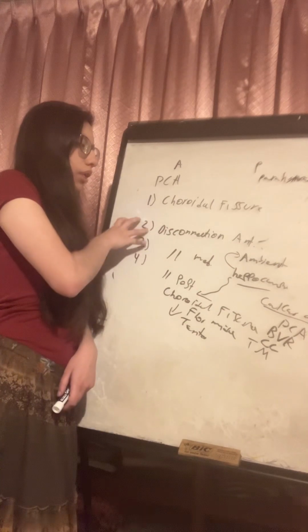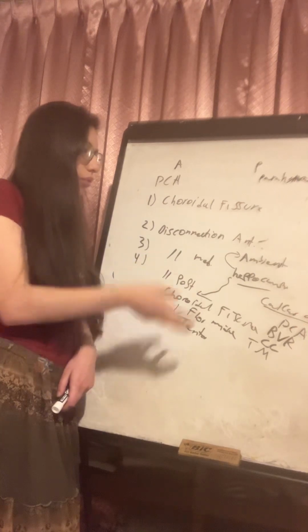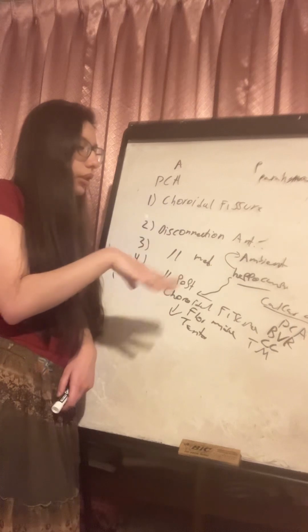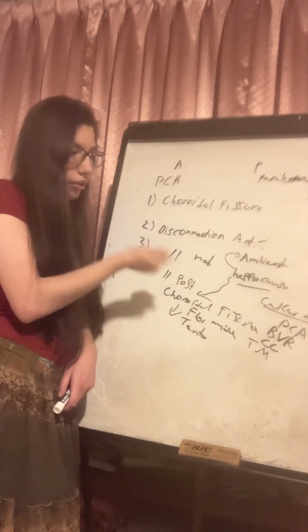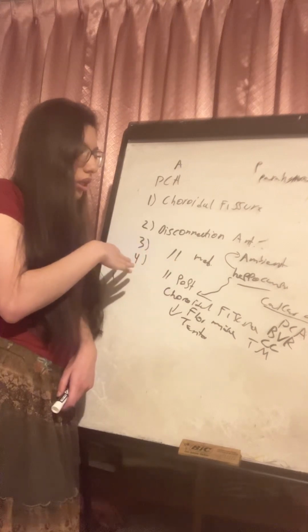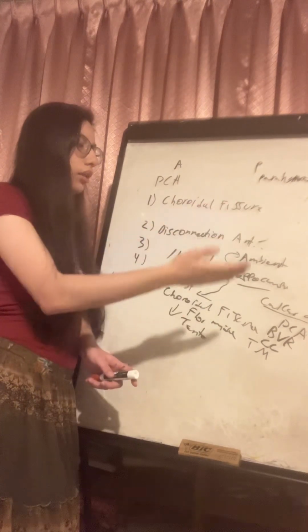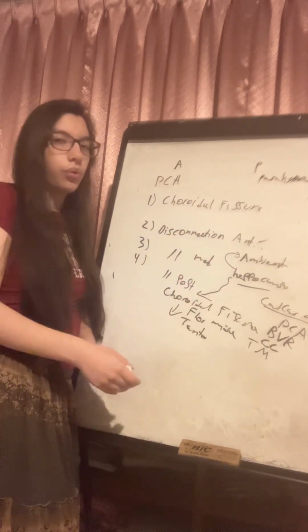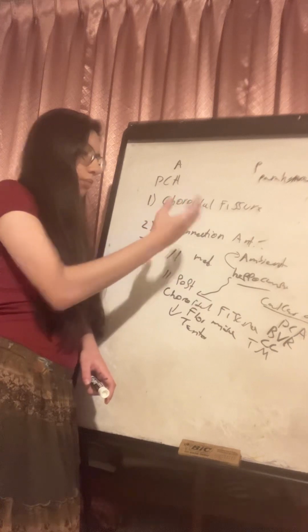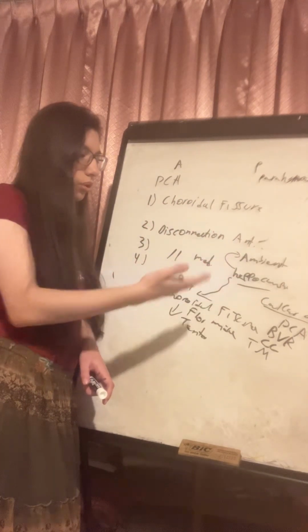Then we have the anterior disconnection, that is the disconnection of the head of the hippocampus from the uncal recess and the medial wall of the temporal horn. We follow the uncal recess and the hippocampal head. We reach the vertex and posterior segment of the uncus, respectively. Then we expose the arachnoid membrane that is just medial to those structures.